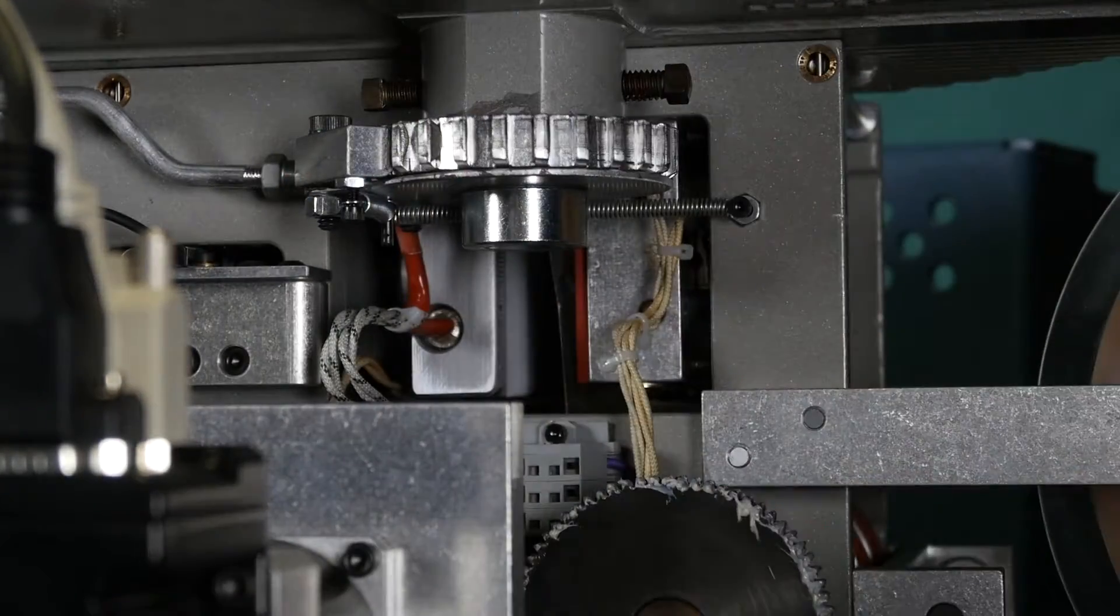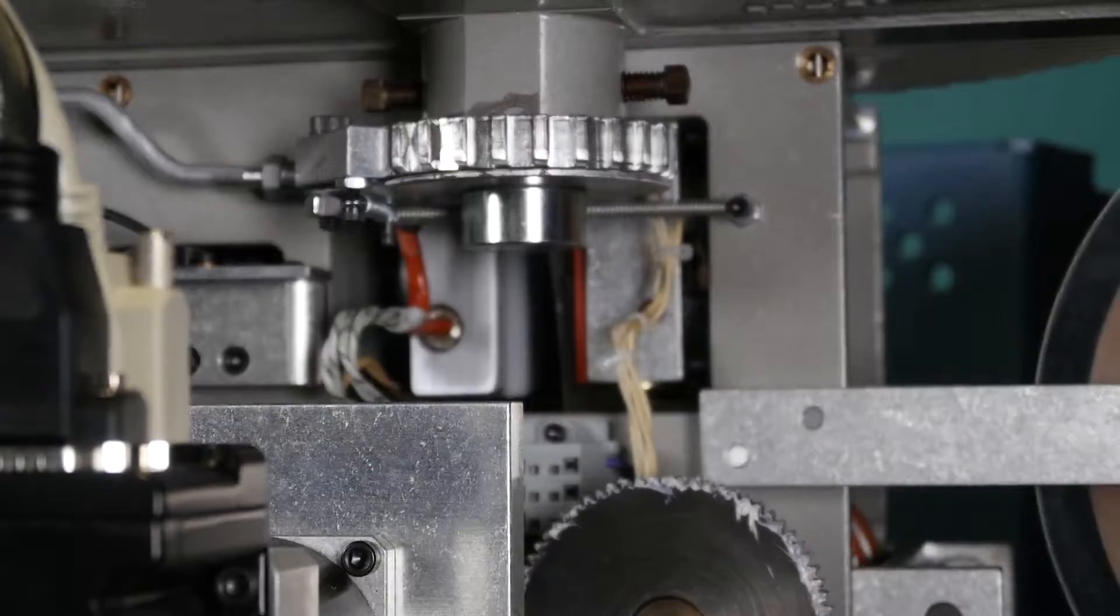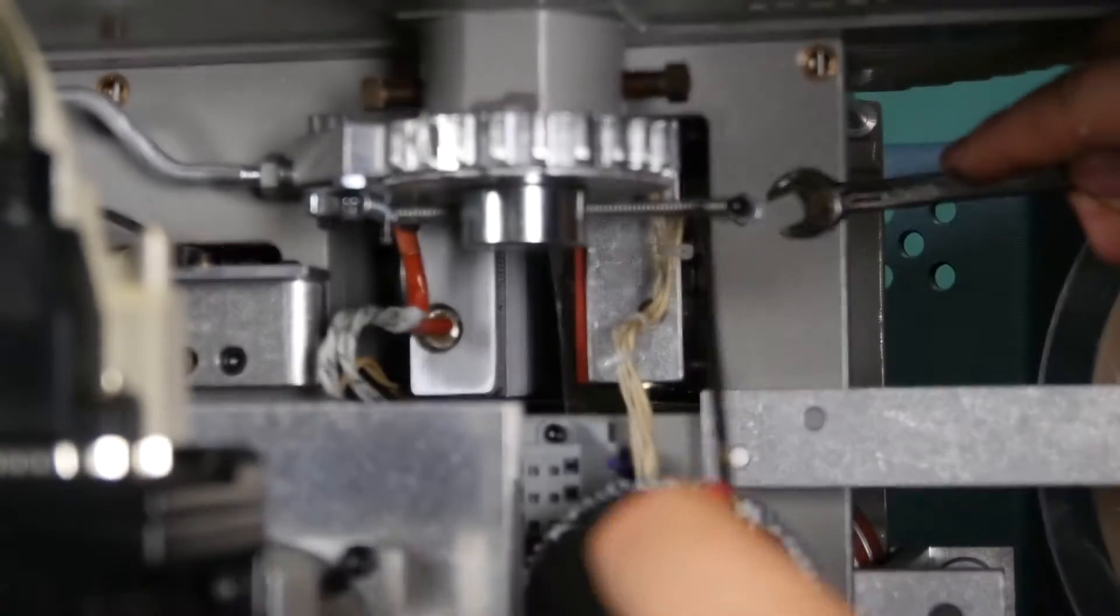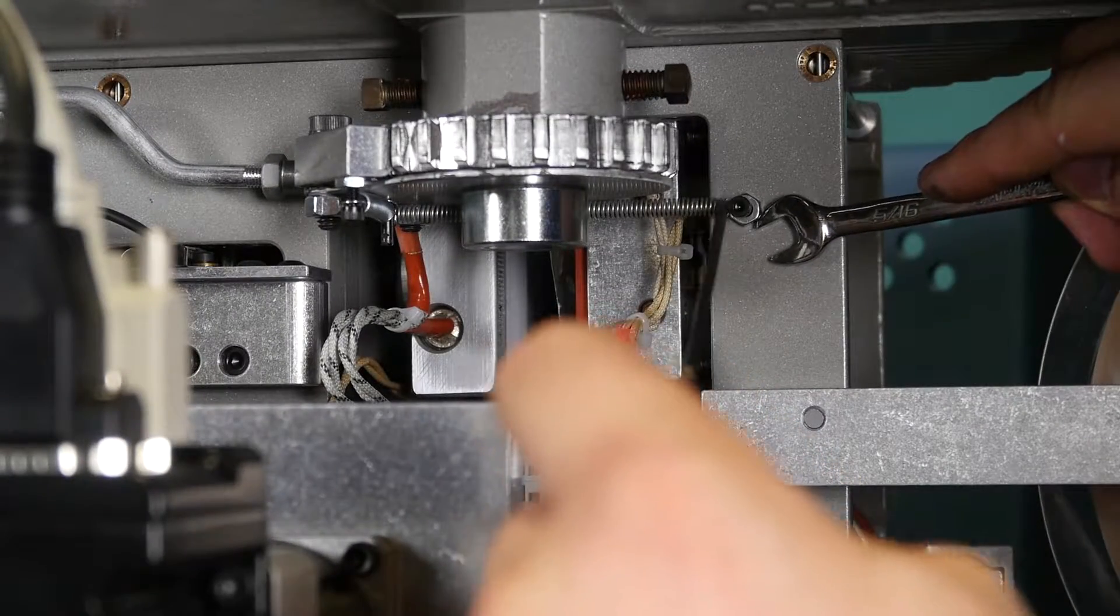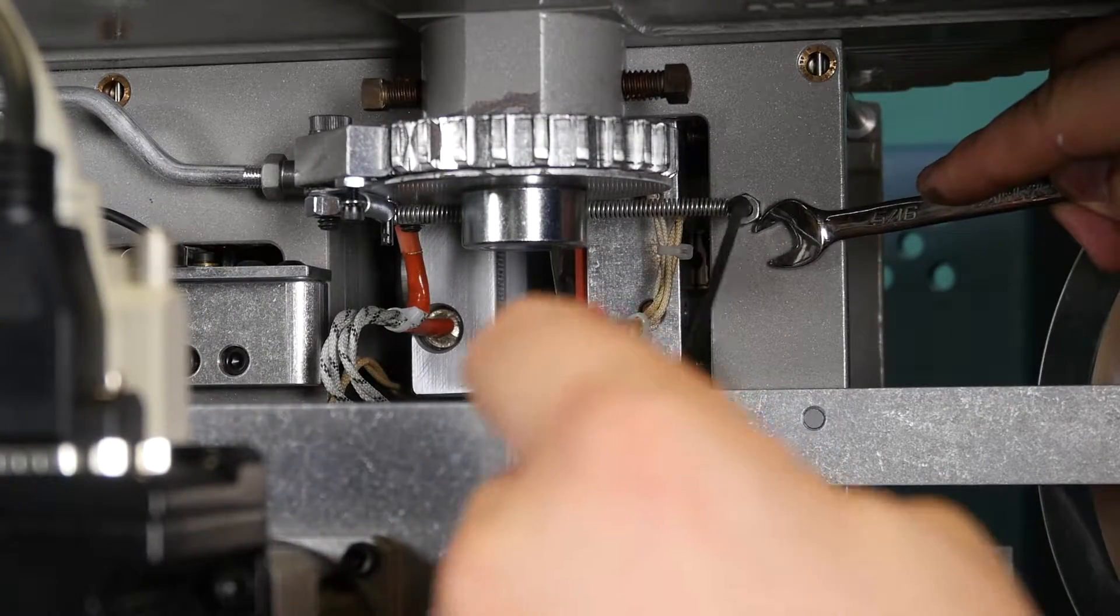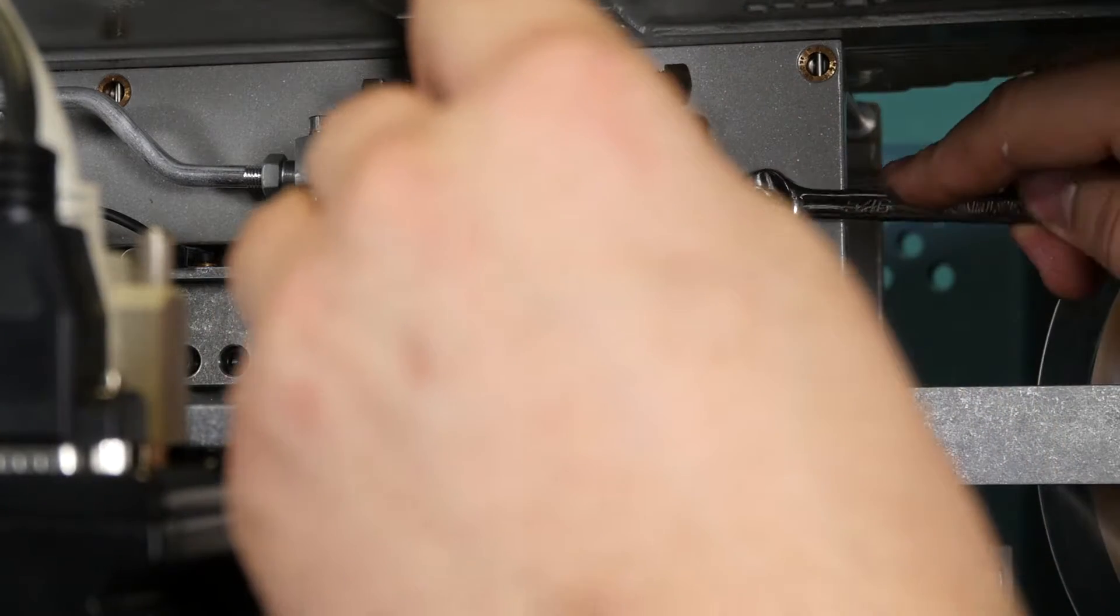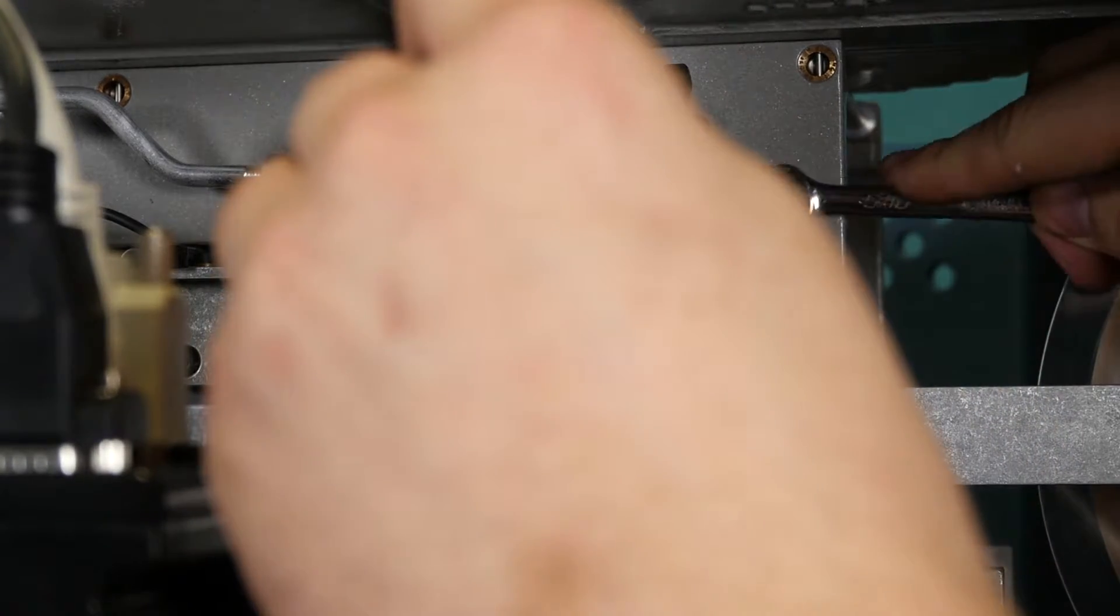Next, screw bolt into frame. Take a 5-16 wrench while holding the bolt and tighten down toward frame so screw and nut are secured.